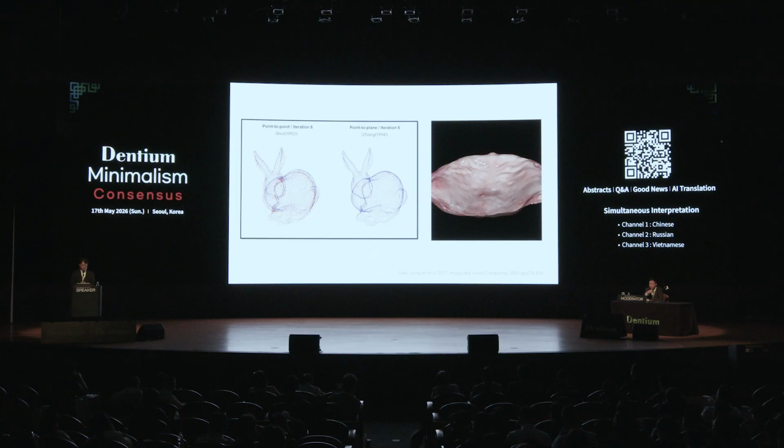Point-to-plane ICP can control vertical movement efficiently, but it may be weaker in horizontal alignment, relatively weaker. A drift error can occur more easily in flat areas where many normals point in a similar direction. For example, the central palatal surface of the upper jaw or a denture.